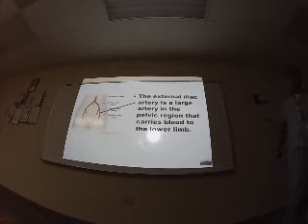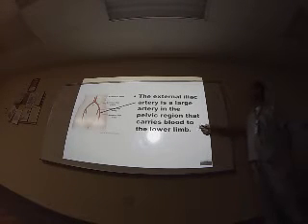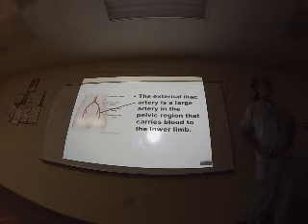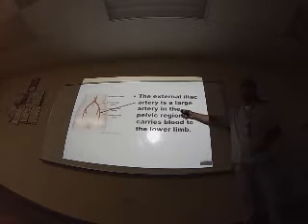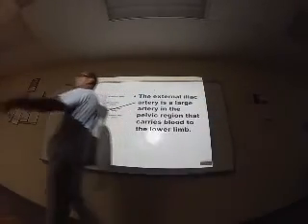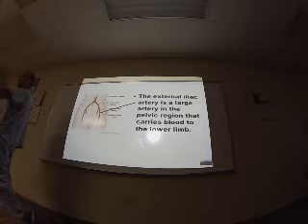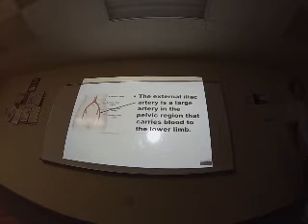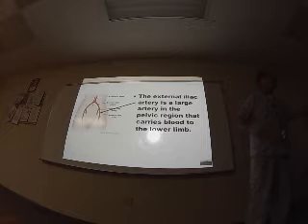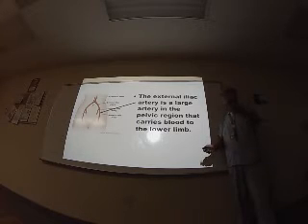The external iliac artery is a large artery in the pelvic region that carries blood to the lower limb. Important for us, because we scan the femoral, and sometimes the femoral protocol includes one picture of the external iliac. You move a little superior and you can take a picture of the external iliac. Arterial studies of the lower limbs are very common studies. It's important to know what the most important protocols are, because it's not the same, a protocol that you do one time a year and a protocol that you are going to scan every day.